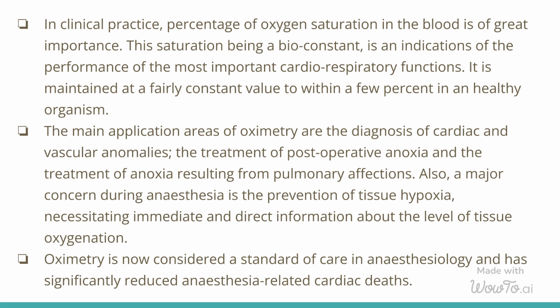Additionally, oximetry has found applications in sports and fitness monitoring, allowing athletes to track their oxygen levels and optimize their training. Furthermore, oximetry is increasingly being integrated into wearable devices and mobile apps, enabling individuals to monitor their oxygen saturation levels at home and receive early indications of potential health issues. Overall, oximetry applications have revolutionized patient care and wellness monitoring by providing quick and non-invasive measurements of oxygen levels in the blood.